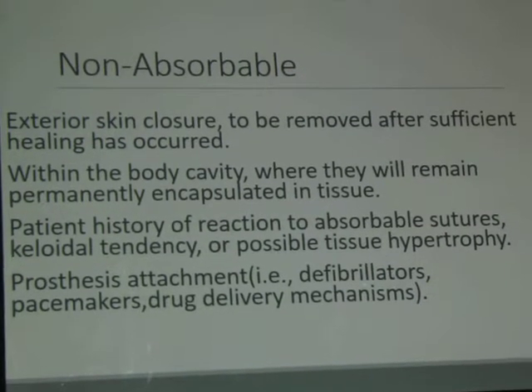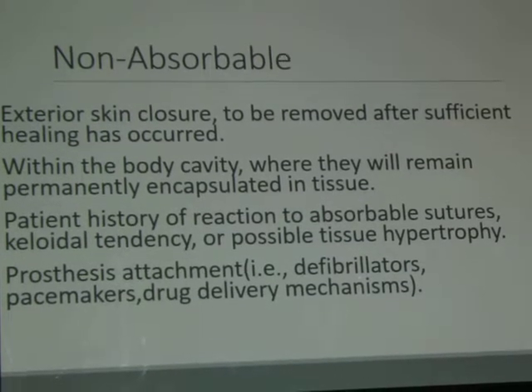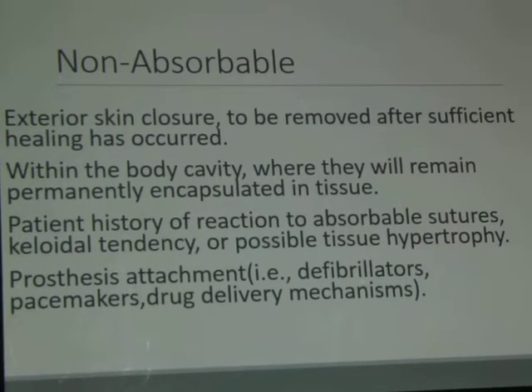Non-absorbable sutures are used either on the skin externally, so we can remove them, or in the places where we have to have a secure bond.